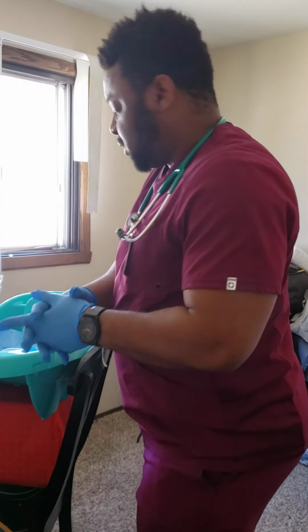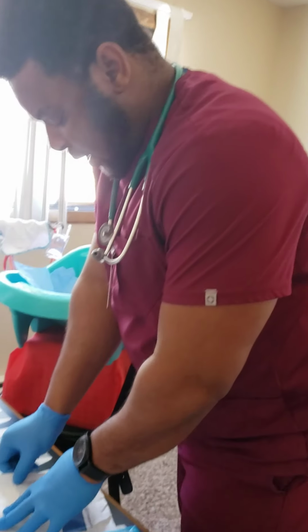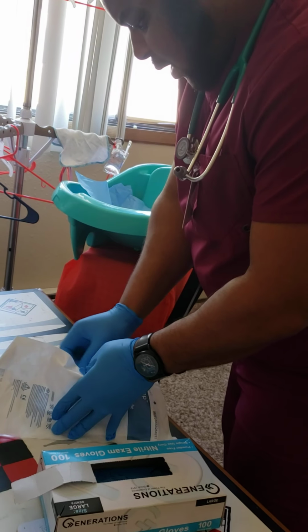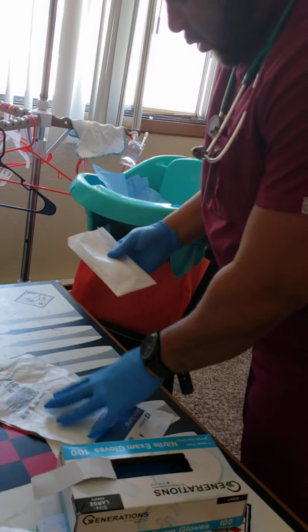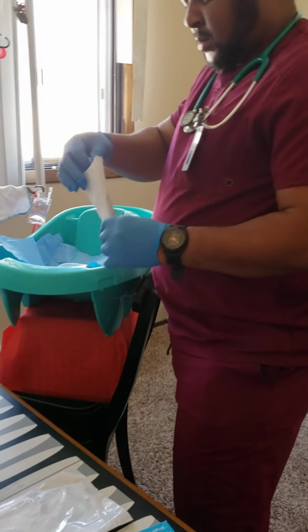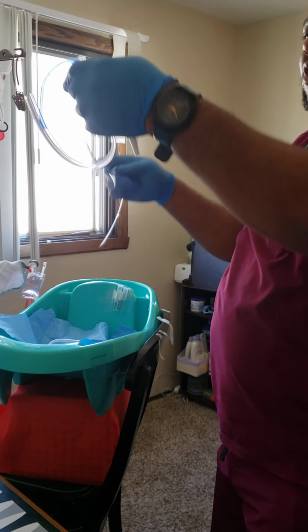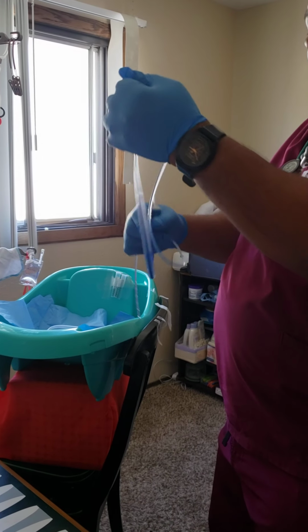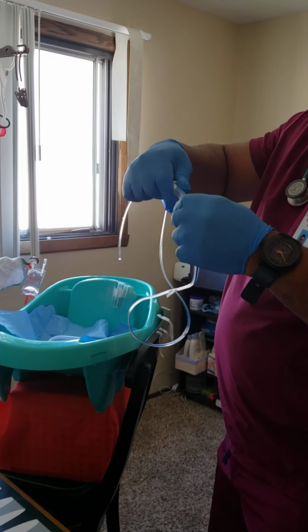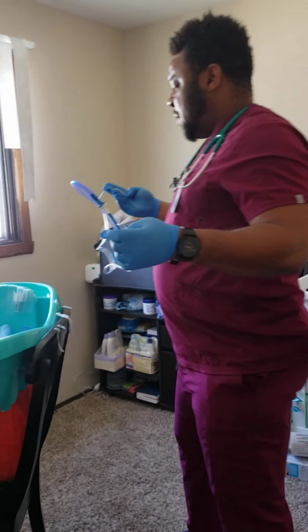So after putting on my gloves, I'll go ahead and open my salem sump, which is right here. I want to make sure my salem sump is clamped. Go ahead and clamp my tube. After clamping my tube, I will now go to my patient.